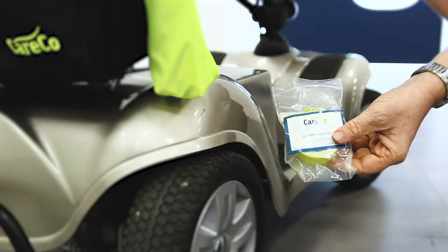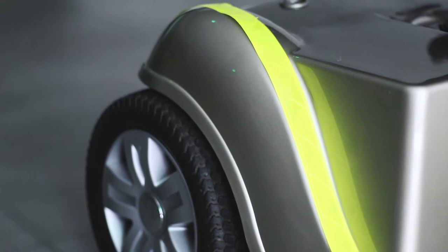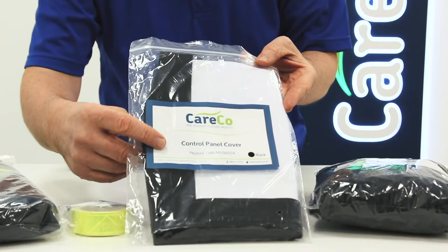Next is a roll of glow reflective tape to help you and your scooter stand out after dark. The tape can be cut to size and stuck to any panel on your mobility scooter to ensure maximum coverage and visibility from a distance, helping others react safely to your presence.